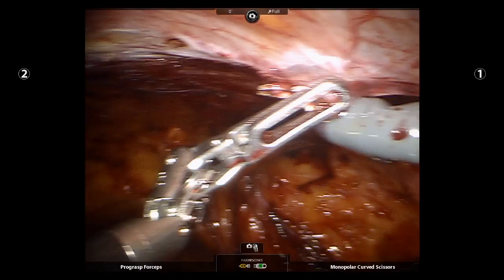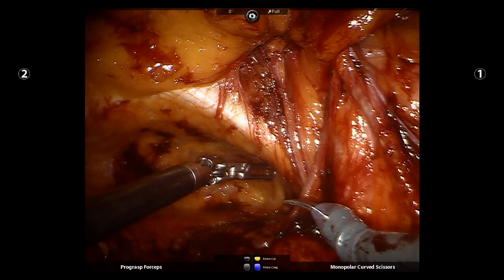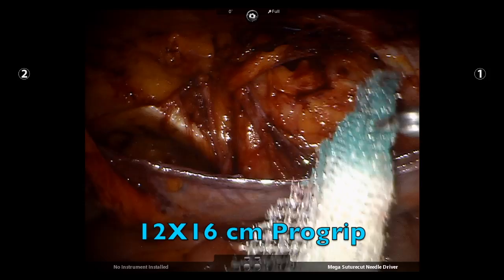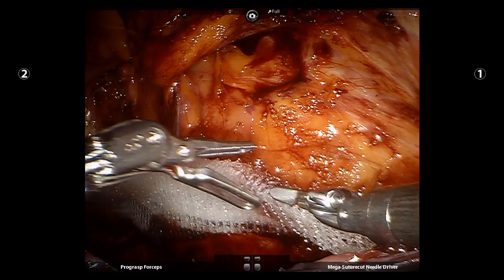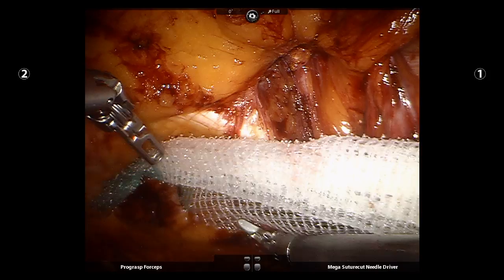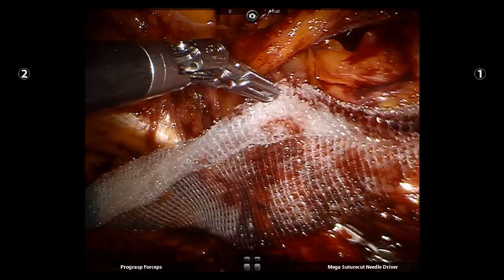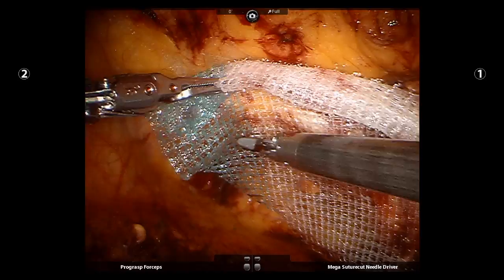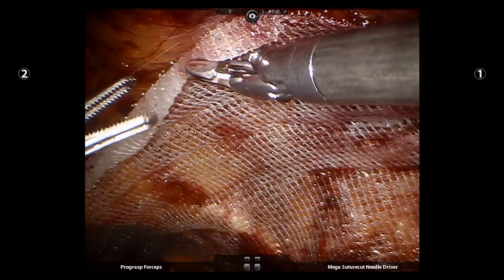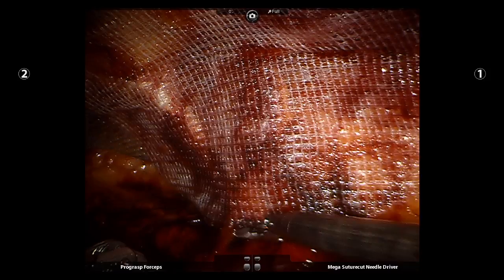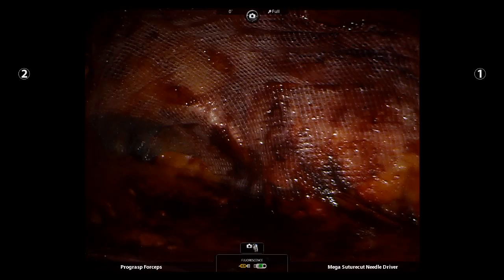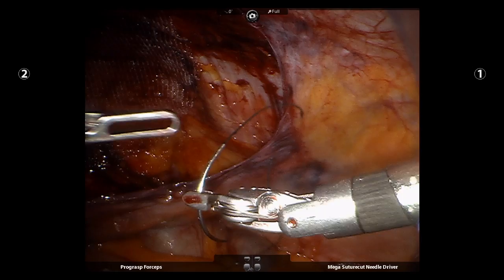The upper lip of the peritoneum is dissected to facilitate subsequent closure. This is a 12 x 16 cm sheet of ProGrip mesh. Note that the inferior edge of the mesh is remote to that of the inferior edge of the peritoneum. Also note that with peritoneal manipulation, the inferior edge does not clamshell. My resident then completes peritoneal closure utilizing 3-0 V-Lock suture.